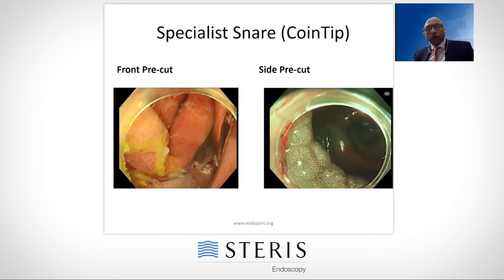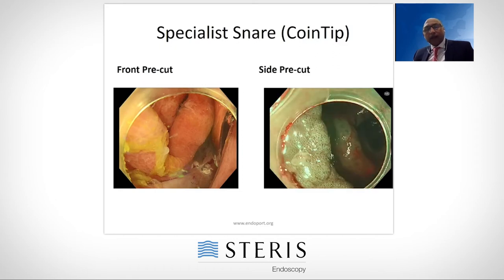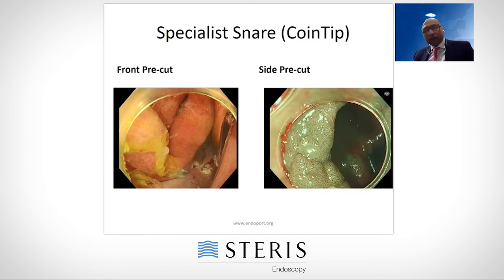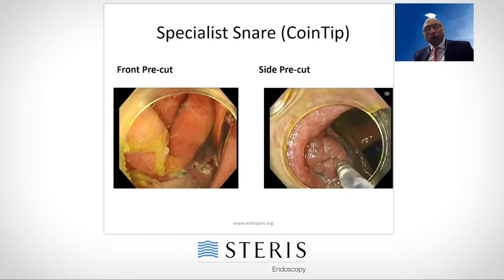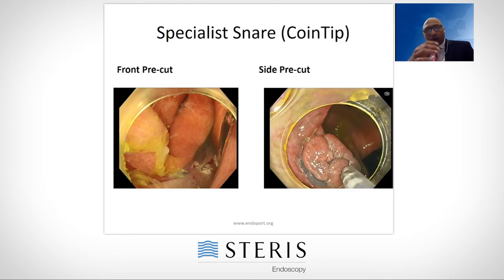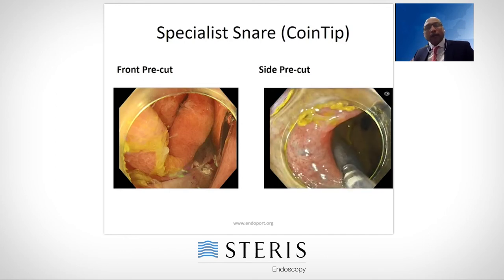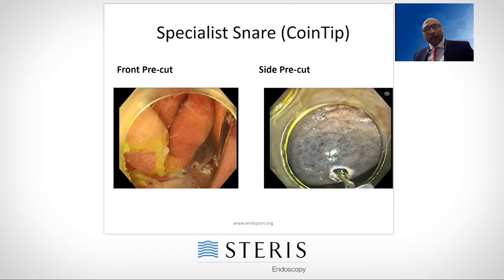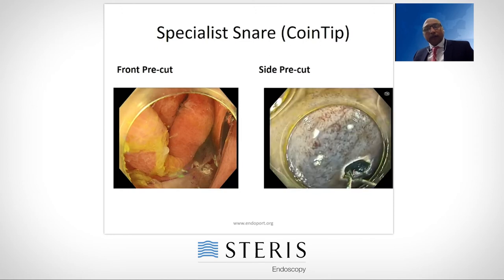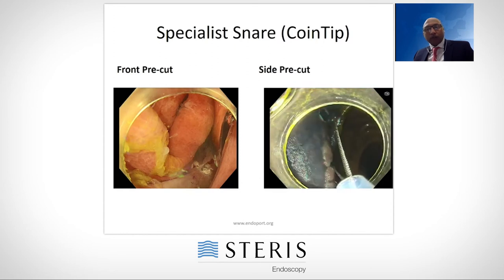Here we will use this coin tip snare to resect a large adenoma as a hot EMR, but this time I'll use the tip of the snare to do a pre-cut on the side. As I said, the polyp is growing on the fold, so rather than going across the fold, I'll go along with the fold. That's why I want to do a pre-cut on the side — you see that. So this is a pre-cut on the side of the polyp. Hook the snare into this pre-cut.